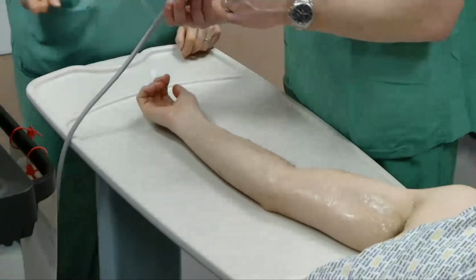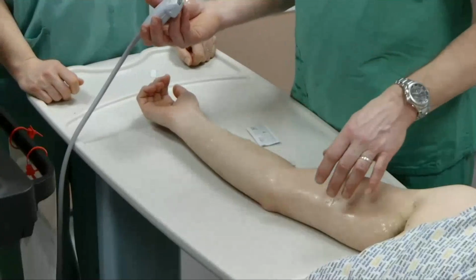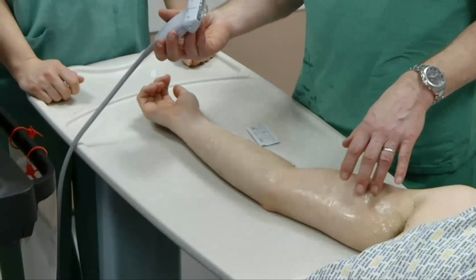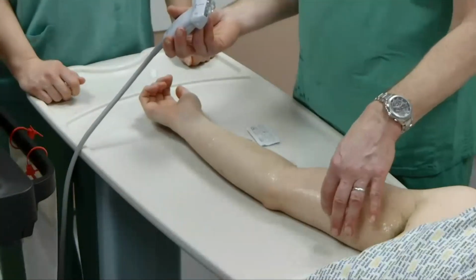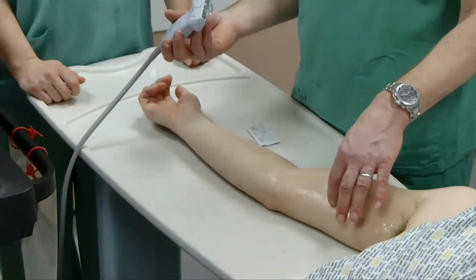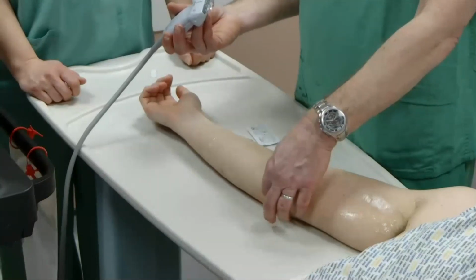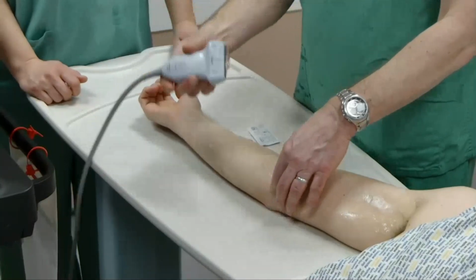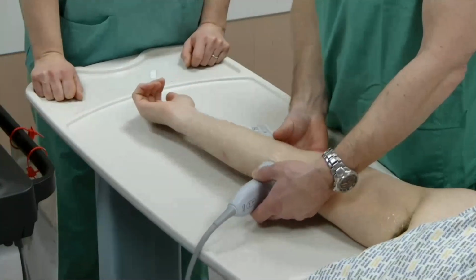And so we can tackle that in the proximal forearm. It's a bit difficult to follow in the upper arm because it doesn't have any nearby vascular structures. It runs quite a subcutaneous course in the upper arm, so there's nothing to easily pinpoint it. Then it goes around in the ulnar groove, and again, this is a hard bony landmark which we can't image very well.